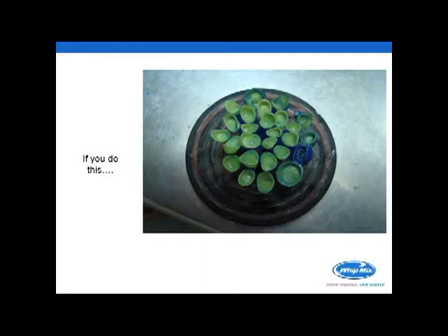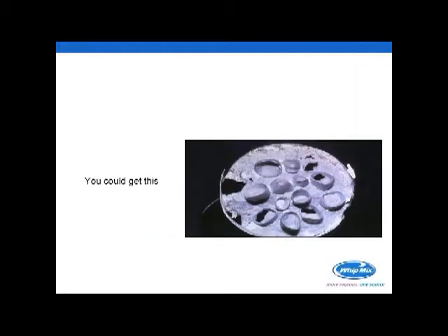But unfortunately, if you're not monitoring where the mass of wax is, in this case in a horizontal plane, this could be the result that you get. There's just too much wax there. It all expands, cracks that investment prior to the time it ever gets hard, and then you get this monster fin that you try to recover from. We don't want you to do that. It's just too much work. So let's change and do things correctly.